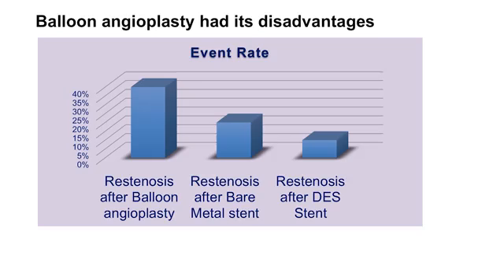How do we do that? We have this small inflator which injects contrast and a little bit of water inside the balloon, so the balloon is filled up, and then pressure builds, pop, the stenosis is open. That was the simple percutaneous procedure of balloon angioplasty. At that time, they just popped the stenosis with the balloon, removed everything, and then checked if the artery was open or not. It was fantastic, this discovery and its application in human beings.